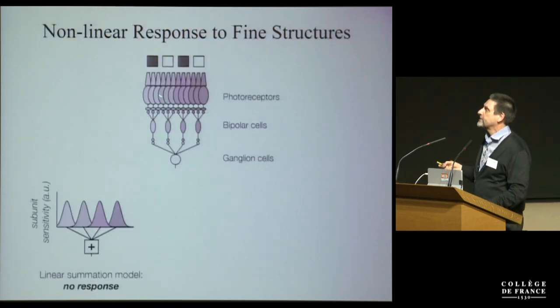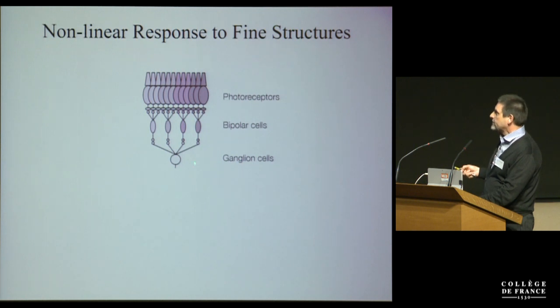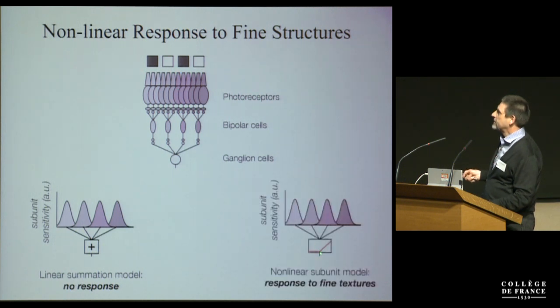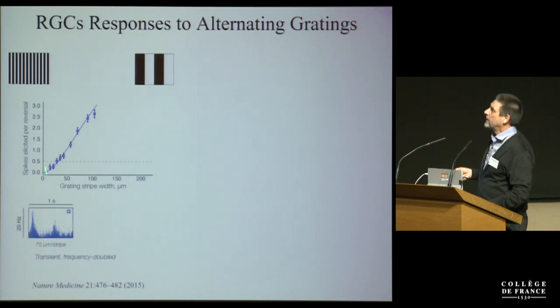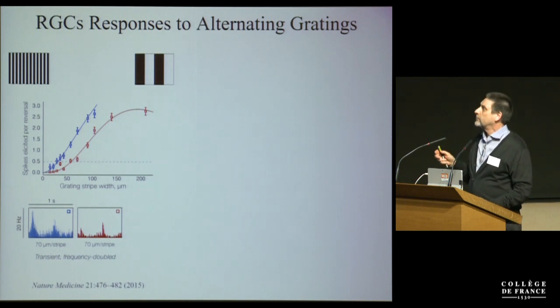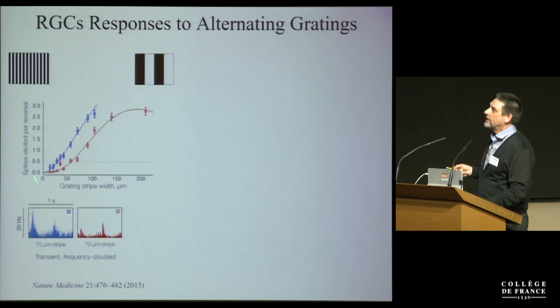If this process of response were linear summation, there would be no response, because all you would see is basically the average brightness on this array. But with nonlinear summation, you see a response. And so this nonlinear summation enables vision with much smaller feature size, the size of a subunit, which is approximately 10 times better than the average receptive field size in rats. In normal vision, all the cells are actually generating second harmonic. They are utilizing this subunit nonlinear summation, and we see the same with prosthetic vision. So it's another benefit of utilizing the retinal network, that we actually have 10 times better resolution, because subunits, at least in rats, are about 10 times smaller than the average receptive fields, about 30 microns versus 240 for the average receptive field. So this is a big benefit if you utilize the retinal network.